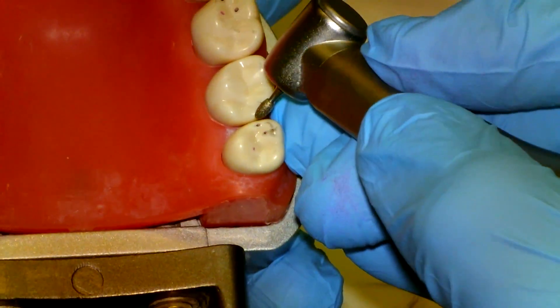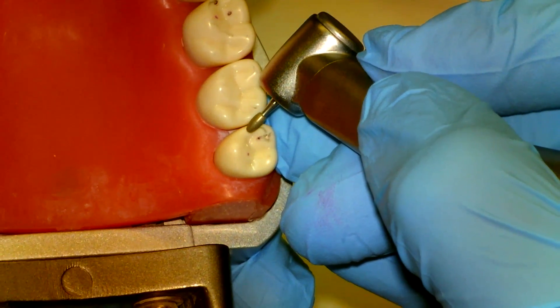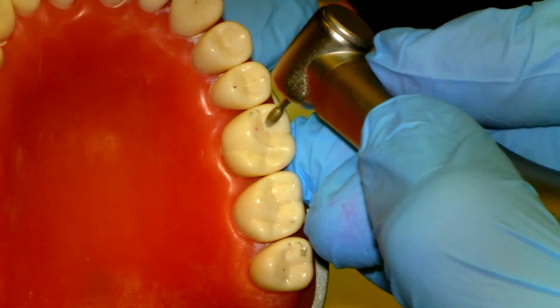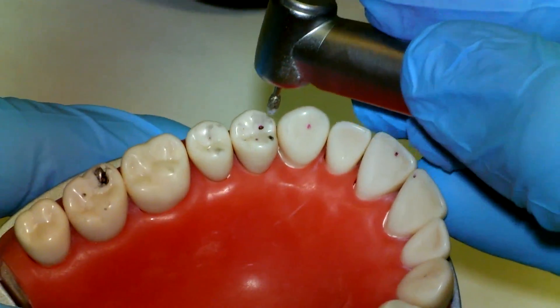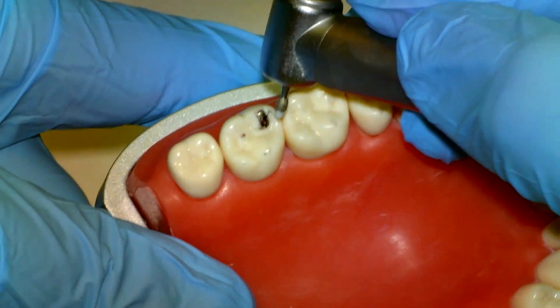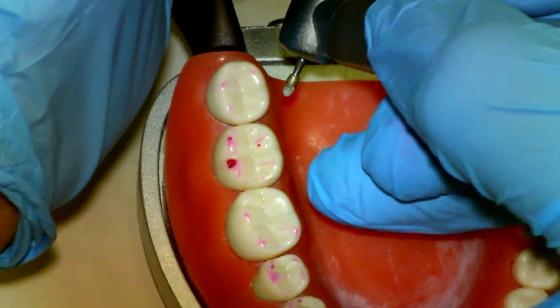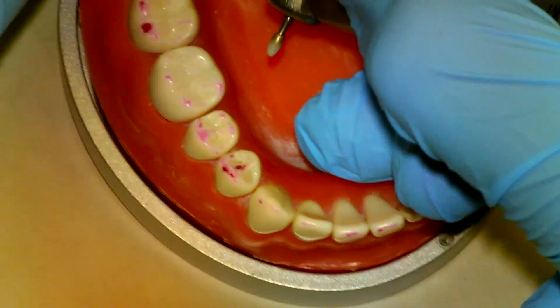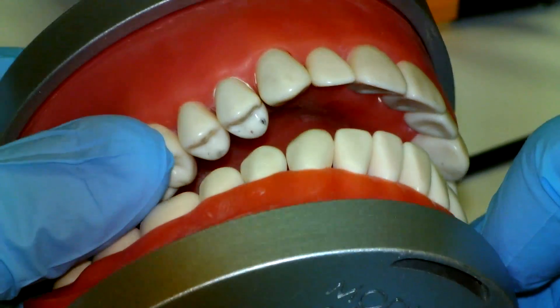When adjusting marks on the very distal third molar, use a red stripe diamond and just very gently brush and touch that ever so slightly to remove the mark. We'll leave the functional cusp alone. The probable false marks we can leave alone. Marks on non-functional cusp inclines we'll buzz down. We'll jump down to the lower and the lingual cusp — these are non-functional cusps, so we're going to remove those marks. Here's a marginal ridge contact we don't want. This incline of a functional cusp corresponds to the incline of the opposing functional cusp, so we have the choice of adjusting either one.